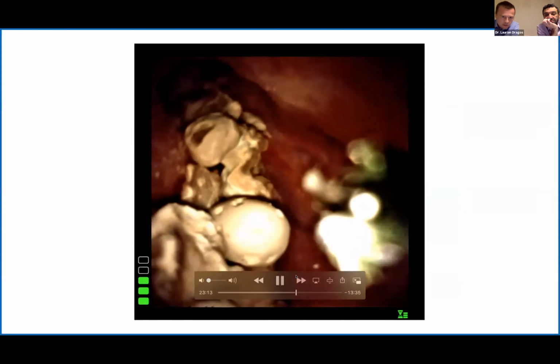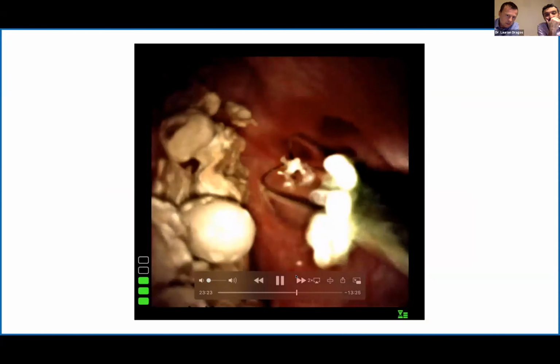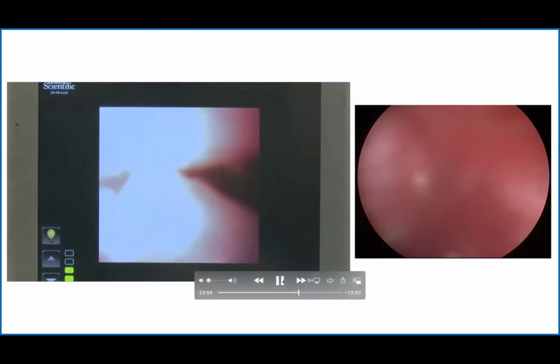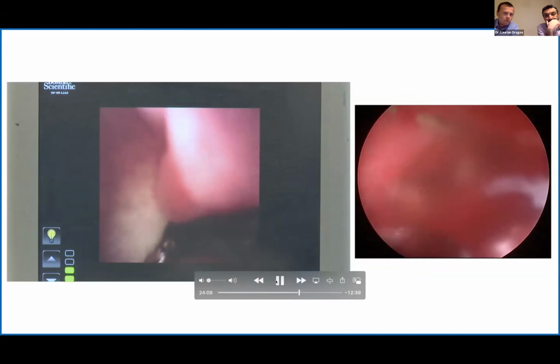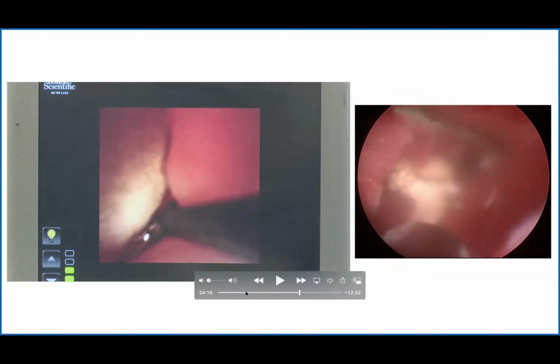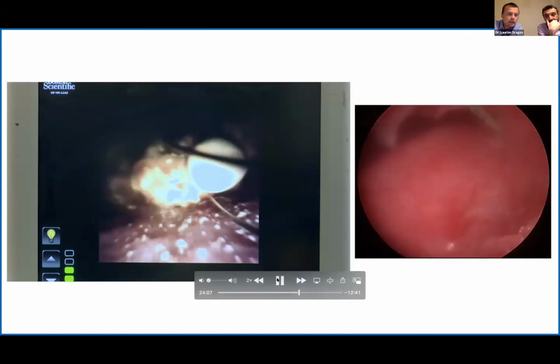It's again a long and painful process. I'm going to increase the video speed. It might be, Laurian, but to be fair, it's a very complex stone, and you're trying to clear the patient in one sitting, which I guess is the advantage of an endoscopic combined approach. You also don't have to do two punctures, so you've spared a puncture. But clearly for a large stone burden, fragmenting and then removing those fragments can be a little bit time consuming and tedious. Yeah, definitely.